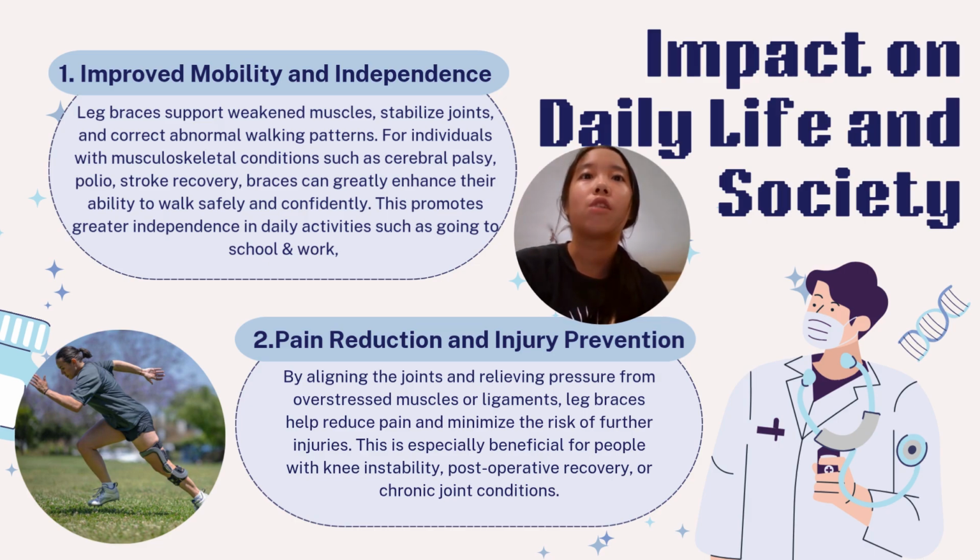This is especially beneficial for people with knee instability, such as certain athletes, or post-operative recovery or chronic joint conditions. As you can see in the picture, a leg brace can help to support an athlete while they are training for an upcoming competition, and it helps the athlete to function better and perform in their sports.